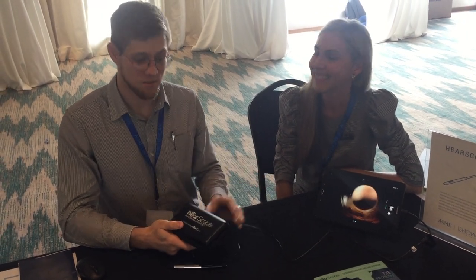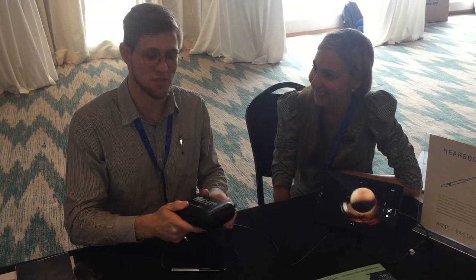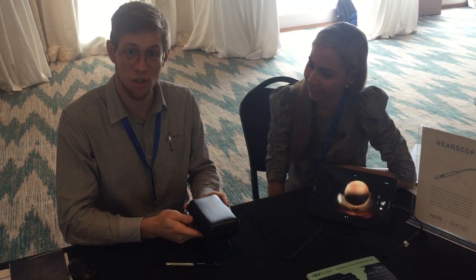Hi everybody, this is Yaku and Tasha from hearX. I'd like to demo the HearScope for you — it's a mobile digital otoscope.